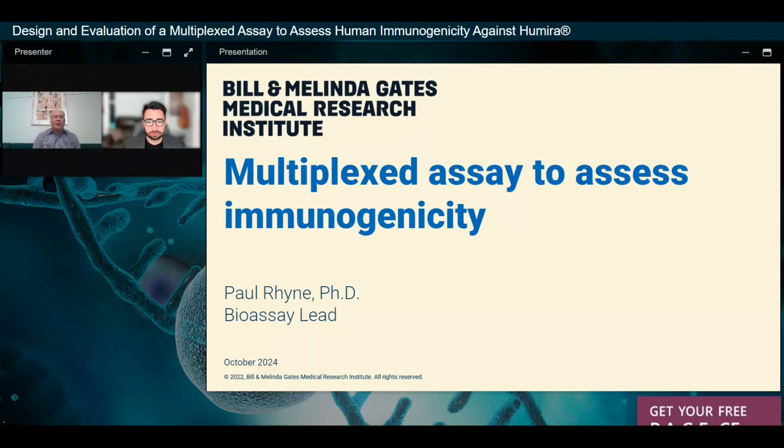You will probably be asked to do subsequent experiments to follow up on that, which you normally wouldn't have to do if you just did a screening assay. So this may not be the right approach for every single drug program, but if you know that there is going to be an interest from the regulatory agencies to look at specific isotypes, you can build that into these screening assays and generate that data early.